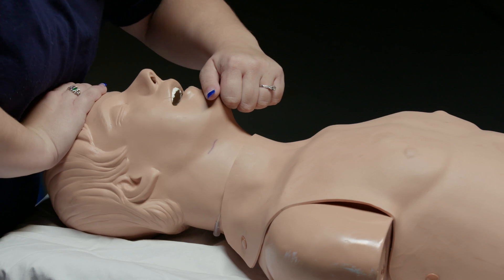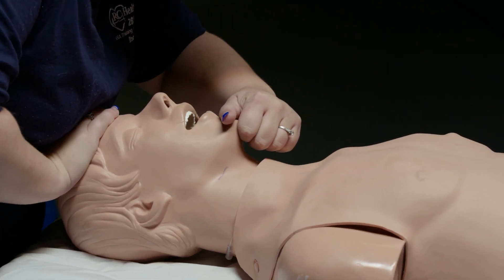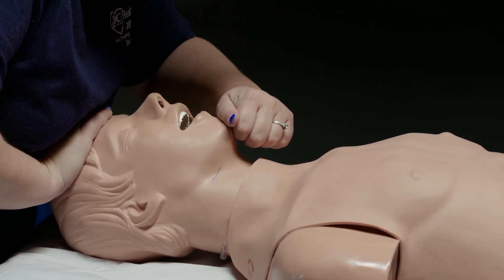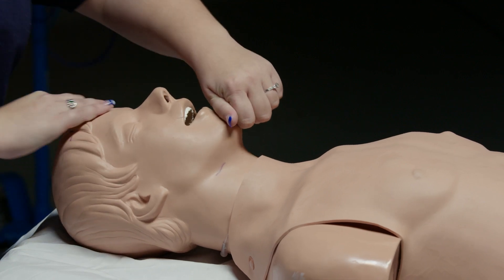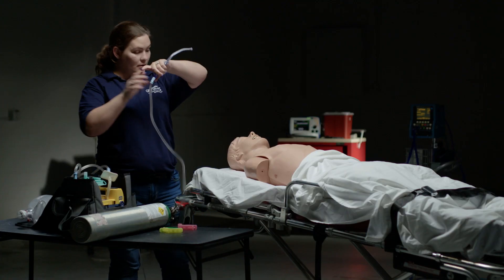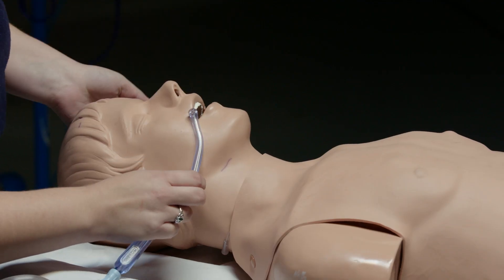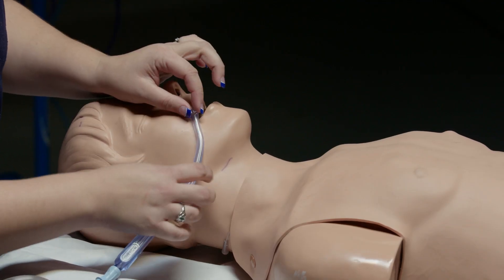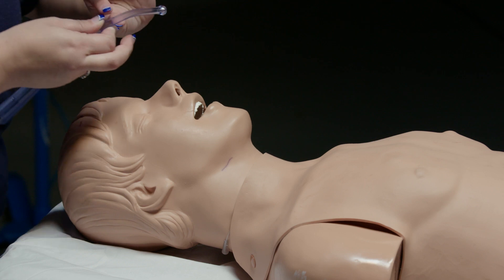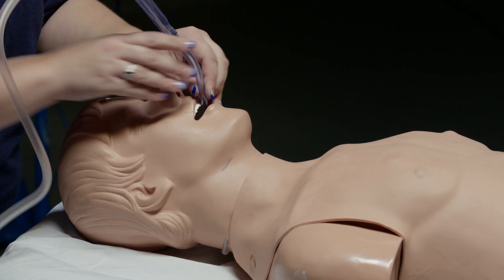In the meantime, I'm going to grab a hold of the chin and perform a head tilt chin lift. Looking in the mouth — the mouth is full of secretions and vomitus. I'm going to prepare my suction unit, take my suction catheter, and measure from the corner of the mouth to the angle of the jaw.